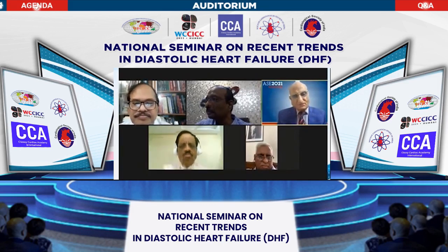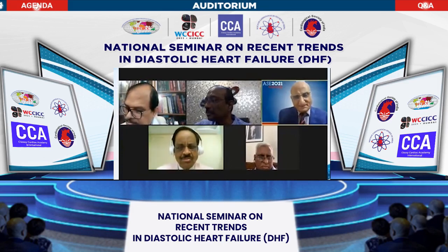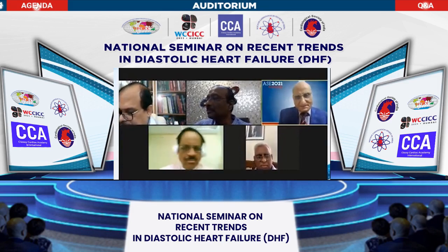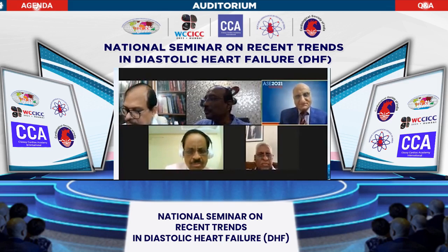And Doppler, as you know, is the first echo method to diagnose this, because there is nothing like early; it is only grade 1. So there are various methods, and various algorithms are done. One of the algorithms taken by the Mayo Clinic in 2020-21 is much more effective. So it is helpful, definitely, no doubt. But there are certain echo features which go on increasing as the diastolic dysfunction increases.